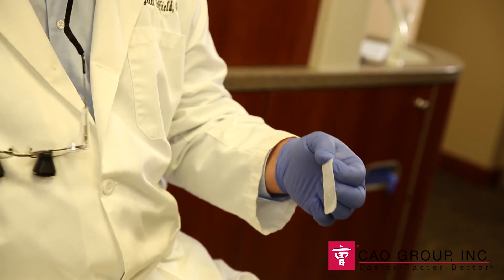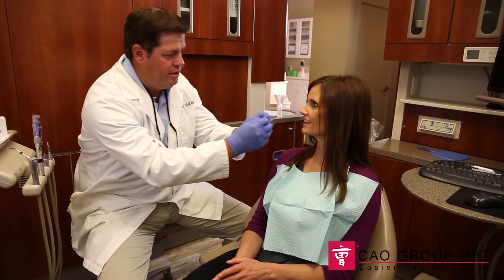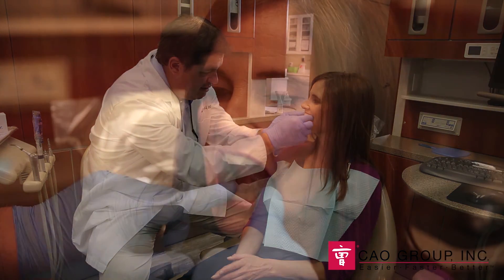First, remove the strip from the package. You will notice that it has the same flexibility as the Shear White Strips. Next, carefully apply the whitening strip to the teeth, both upper and lower arches, ensuring that the strip meets the gum line but does not contact the gingiva.